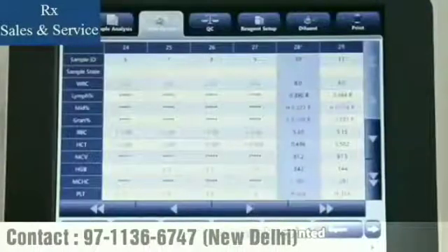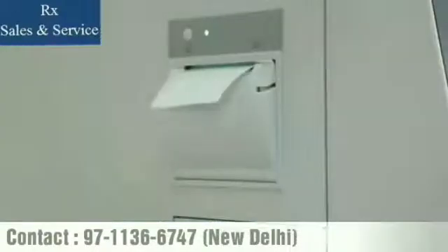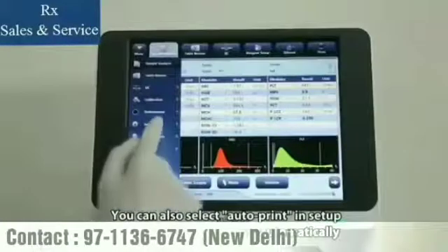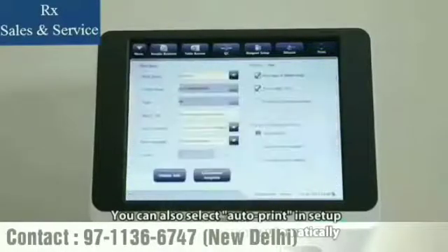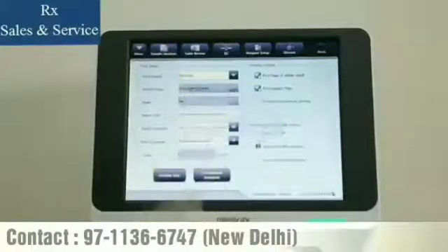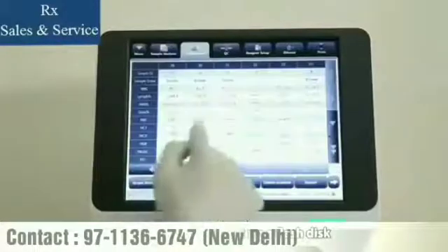Select sample records to be printed and then tap Print to print them out. You can also select Auto-Print in the Setup menu to print out reports automatically. If you would like to further analyze some sample results, tap Export after inserting a flash disk.